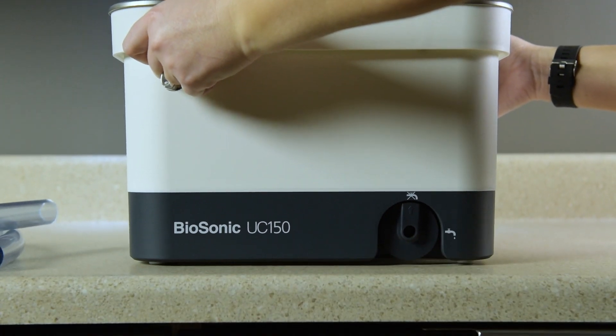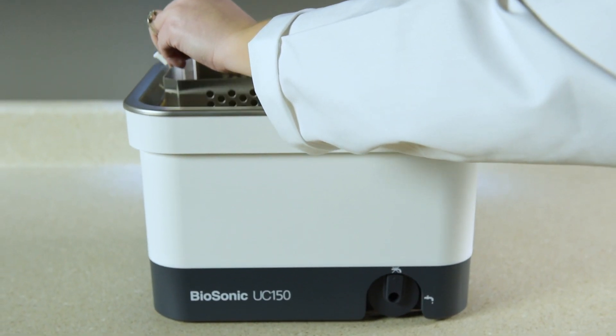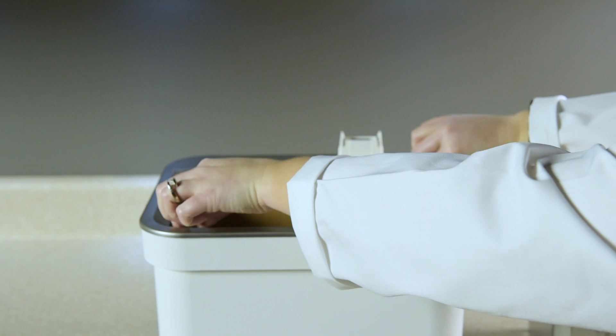Select your desired location for the cleaner. It should be on a solid, level surface either on the left side of the sink or in close proximity to waste lines to facilitate draining.